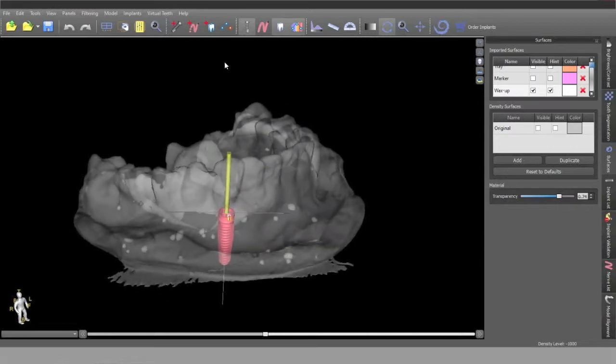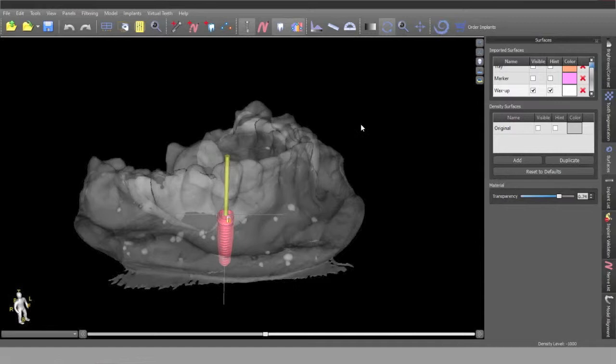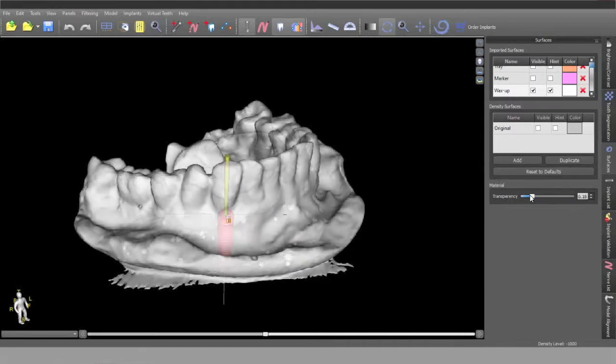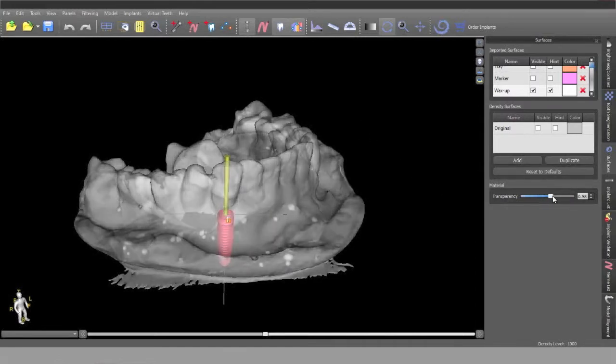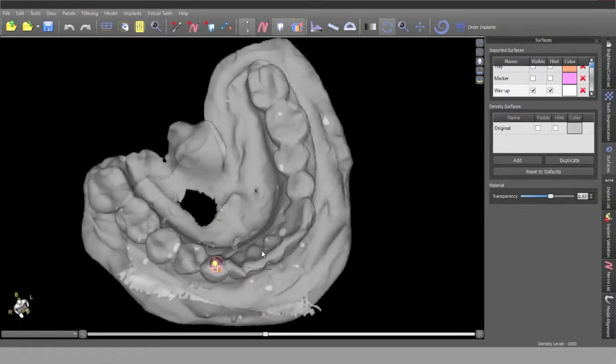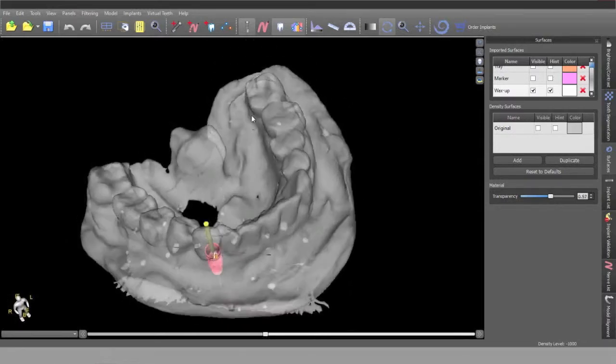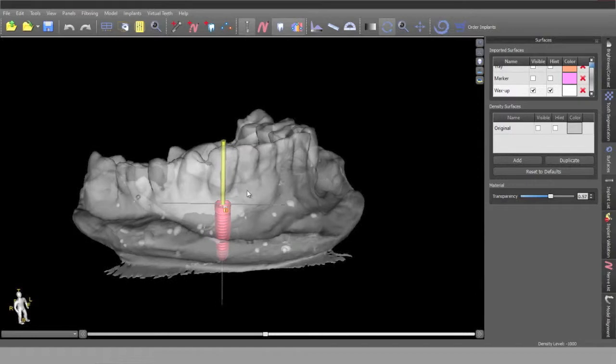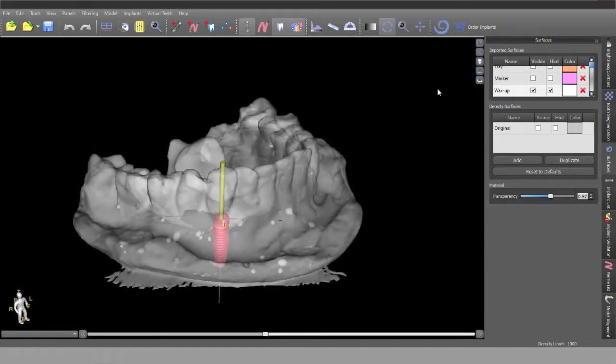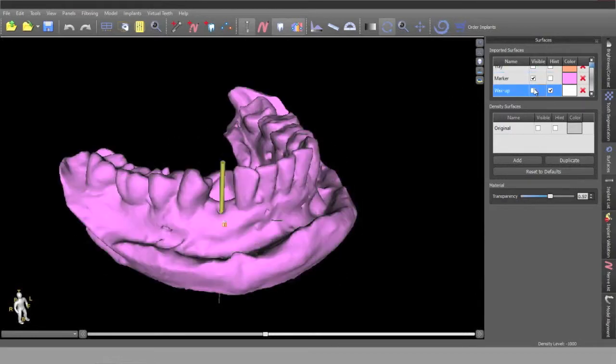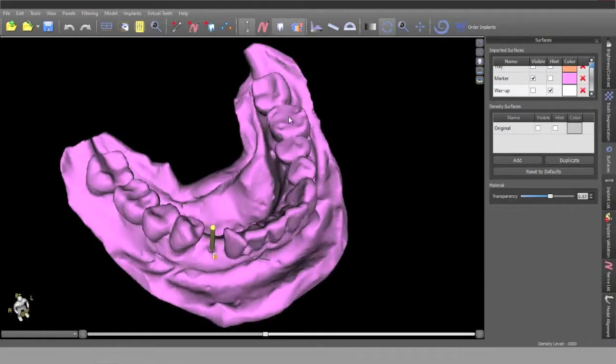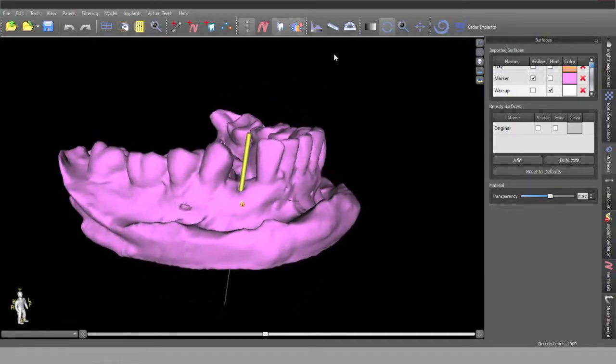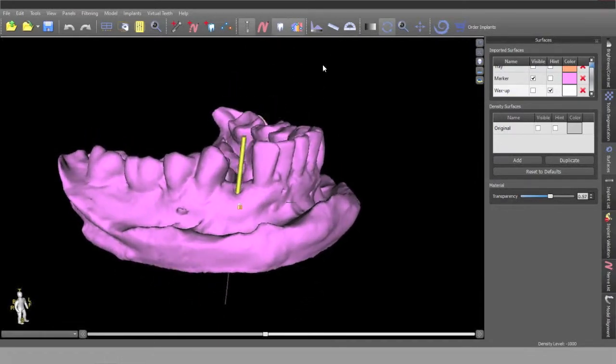But the way we plan the case is by making the model translucent and then placing the implant with its abutment right down the center of the tooth. We also had a marker that we can see, so we can see what that relationship is.